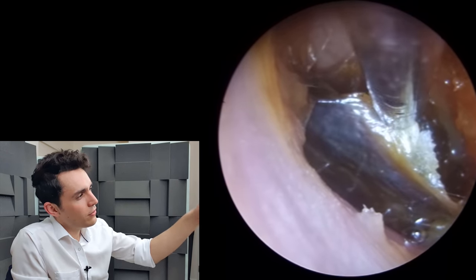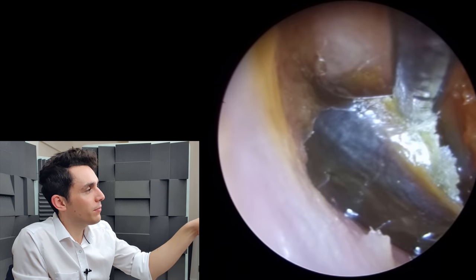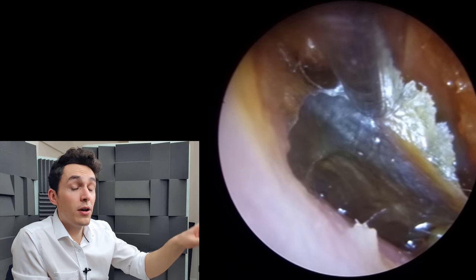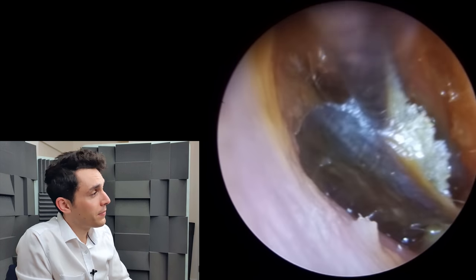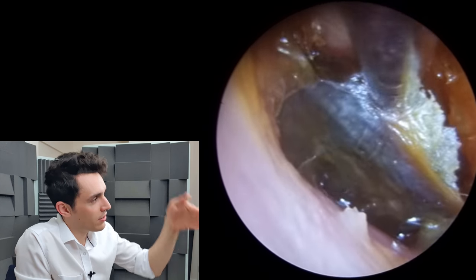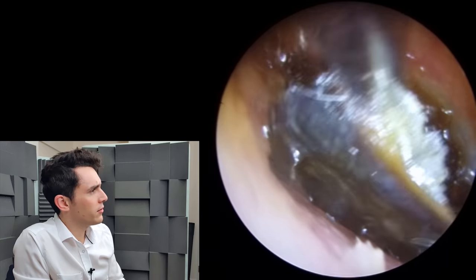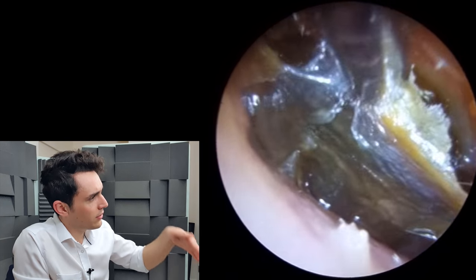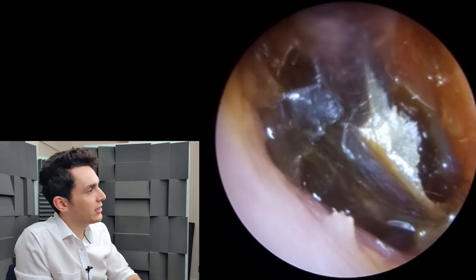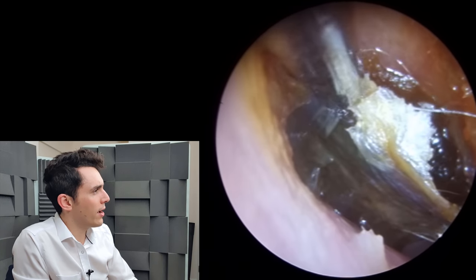If you look at the top left of the ear canal, that's really where I should have been paying a lot of attention, but that's my weak area — top left — because I'm right-handed. It's very difficult for me to get a fine end up in that corner. Now I'm just wiggling it to loosen it up, and the oil is starting to contribute — it's lubricating the canal and reducing the friction just enough that I can start to move it around.